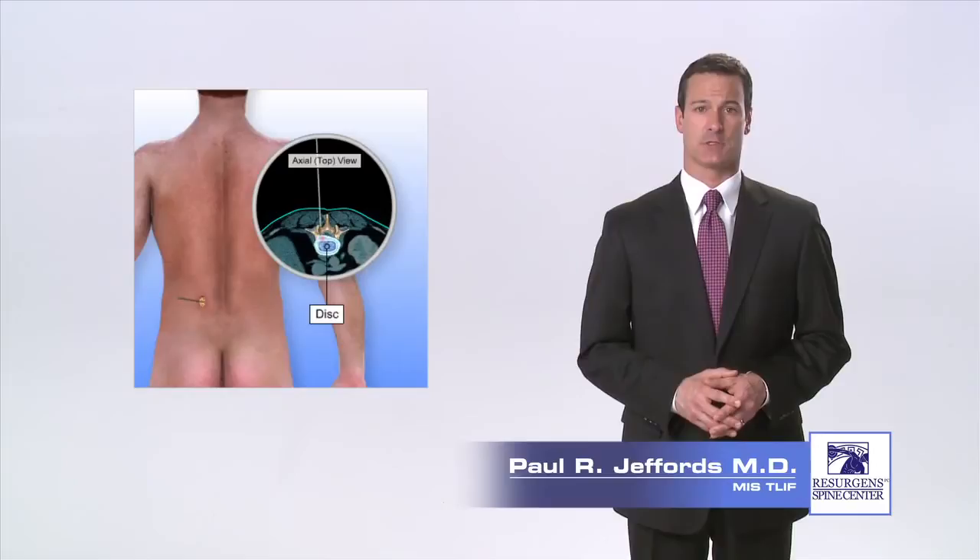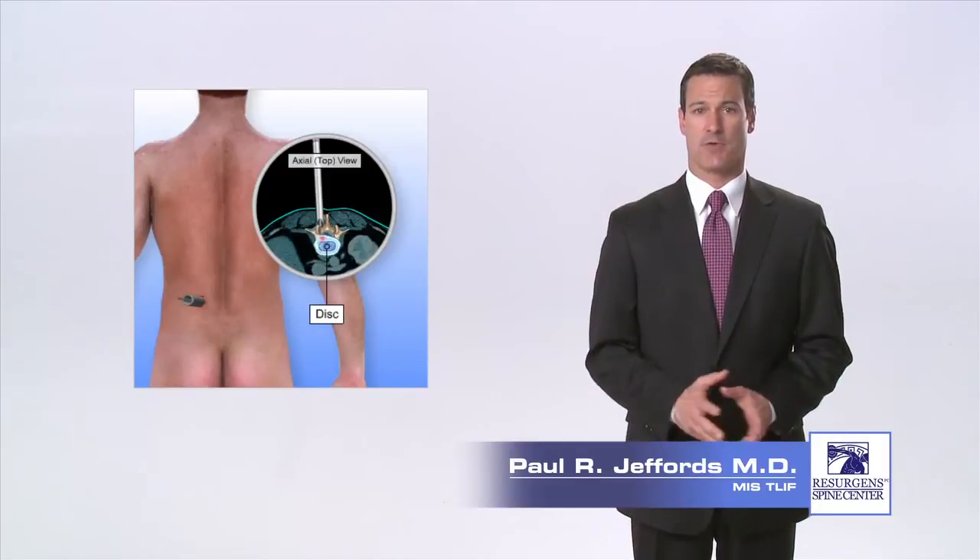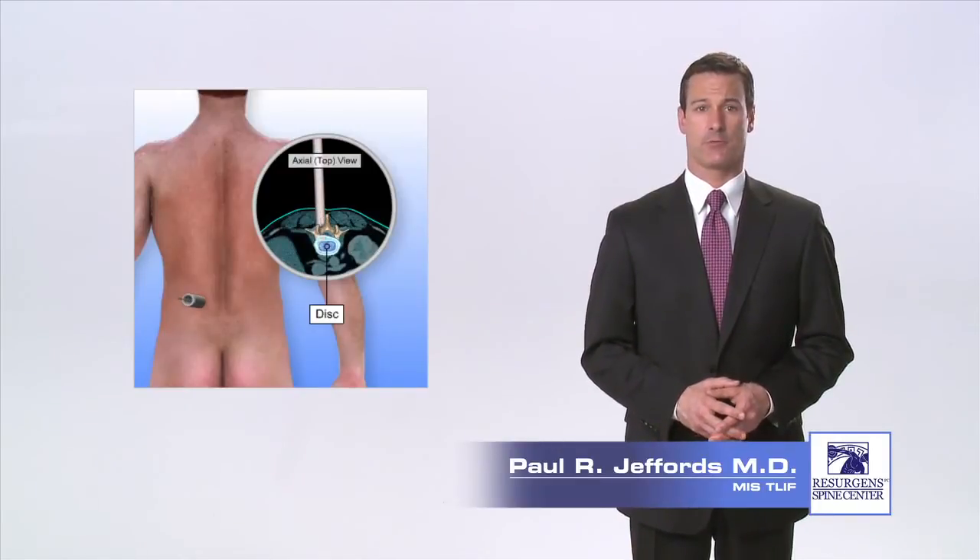Dilating tubes are placed through the incision onto the facet joint of the spine using the fluoroscope to guide their position. The tubes separate the muscle fibers and provide access to the spine without cutting through the muscles.